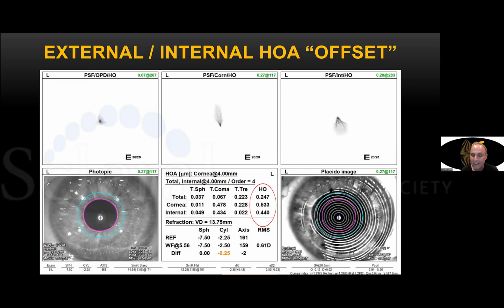So this is a case where a patient may end up actually doing fairly decently in glasses, or even a very draping type of soft traditional disposable lens. They may do better. And I have many patients with keratoconus that have this situation, and they come in and they're doing pretty well in their glasses. They're wearing standard contacts.